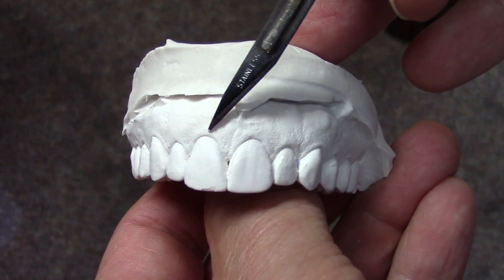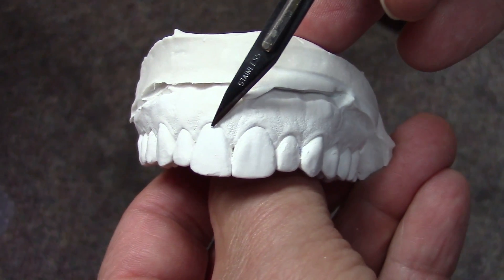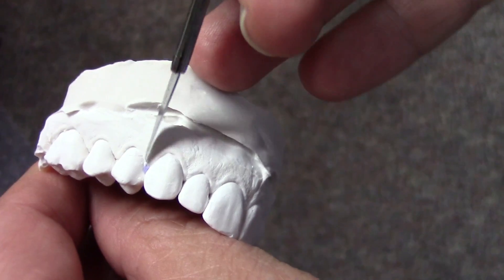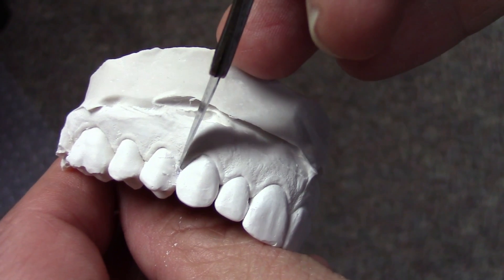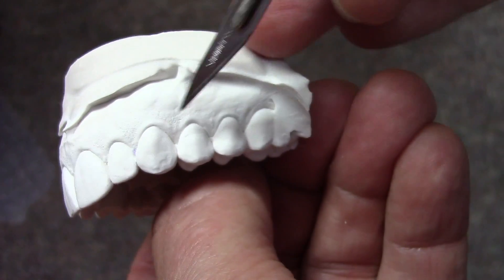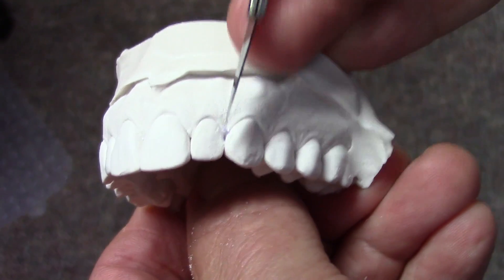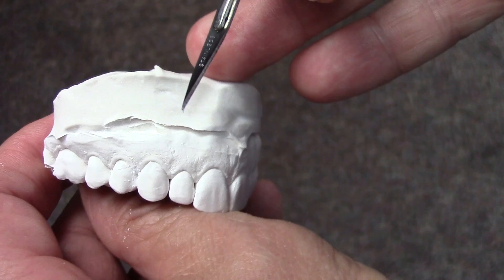We poured the model and I just want to show you how crisp and clean these gingival margins are. If we're going to make any kind of stents, we're going to have a very accurate impression of these margins. Now you might see a little of the material in the embrasures pull out with the model. If that happens, remember that if you pour a second model, that embrasure space is not going to be quite so crisp. So I like to use the very first pour, which is always the most pristine and accurate, after I've cleaned out the embrasures and any impression material.